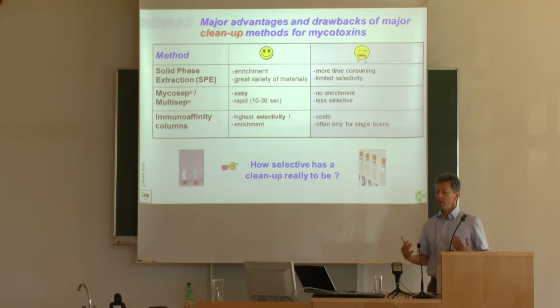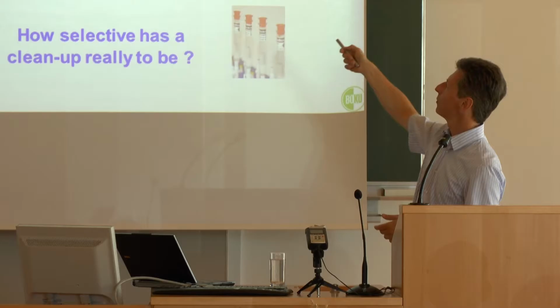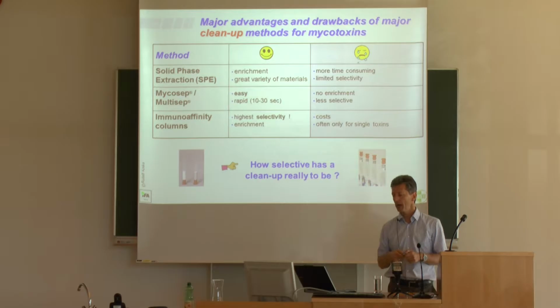Once you have forgotten everything you learned at the Mycotoxin Summer Academy, you can always go back to your script and find a summary of the major advantages and drawbacks of the major cleanup methods for mycotoxins. Here, solid phase extraction has the advantage of enriching the analyte of interest. You also have a great variety of materials available on the market where you can play around with chemical properties.